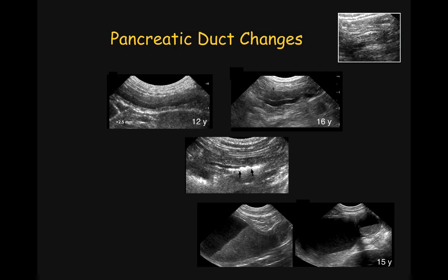Changes in the pancreatic duct in cats are not uncommon. Compared to a normal appearance of the pancreatic duct on the left lobe of a normal cat, we will see a few pancreatic duct changes. They vary from being dilated, like in this 12-year-old cat where the overall diameter is about 2.5 mm, to this 16-year-old cat with a 3 mm wide pancreatic duct with a thickened wall. As we may see in these two cases, the overall diameter of the pancreatic lobe will be affected by this dilation of the pancreatic duct.